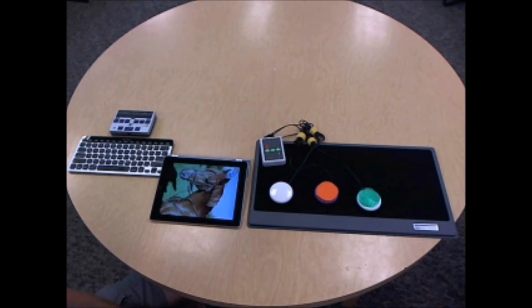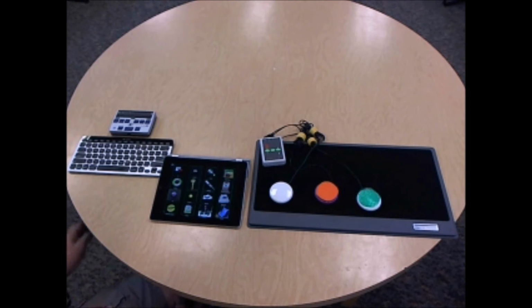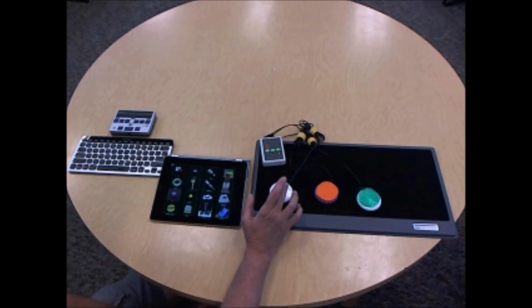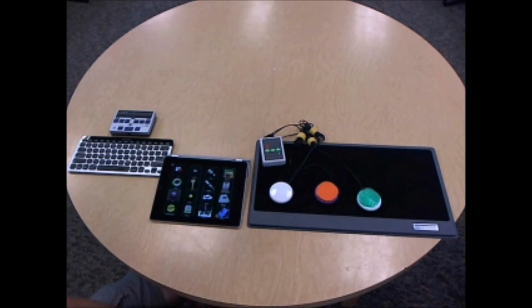So I'm going to show you the next one now. This is Sounding Board. I like books. Ability. Go Talk Now. Sounding. And the way I'm moving through those is on the Bluetooth keyboard. I'm just doing a control tab. So I have Sounding Board. And then I can navigate through Sounding Board with 2 switches, or I could go with 3 if I wanted to go back. PT. Speech. Music. Story time. And then I can just select it. Story time. Can you read me a story?